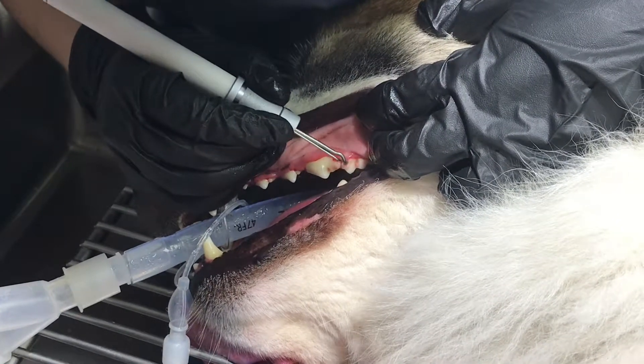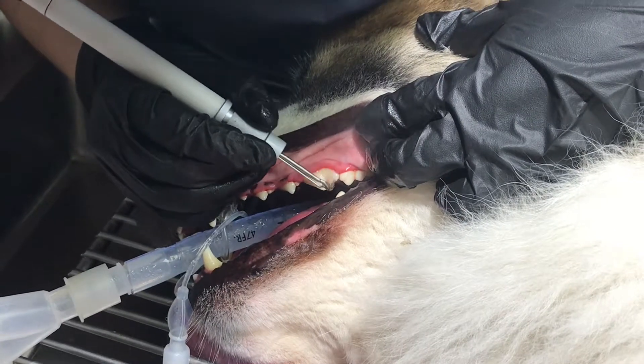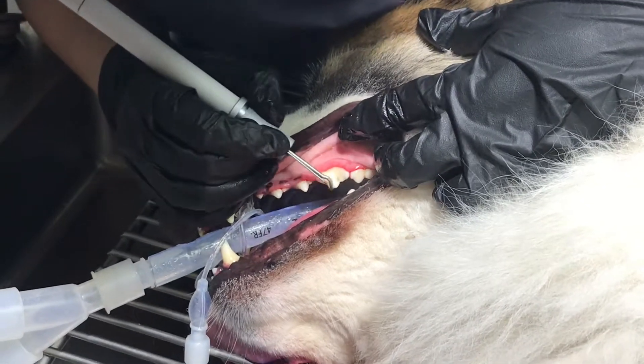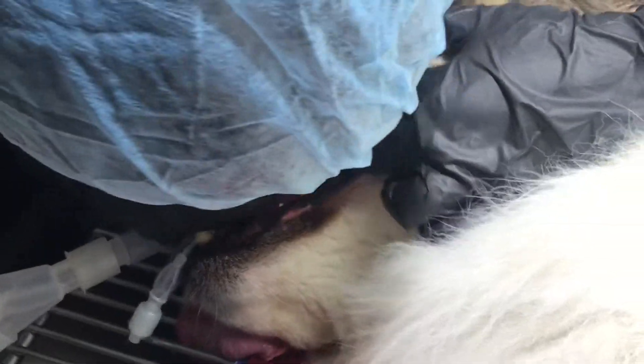While the technician is scaling, they'll let us know if they see any major problems on any teeth, any issues with the gum line, or any growths that shouldn't be there. They'll call those out in real time as they see them, and then when I go back through, I'll do my examination.